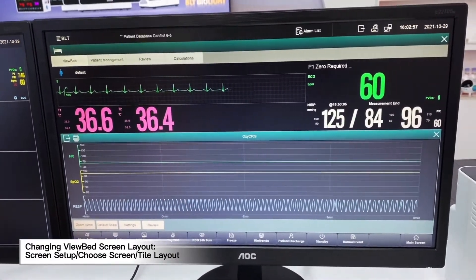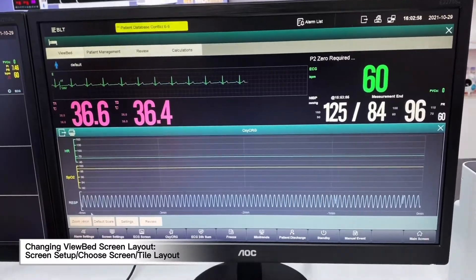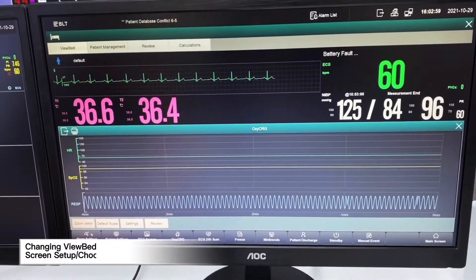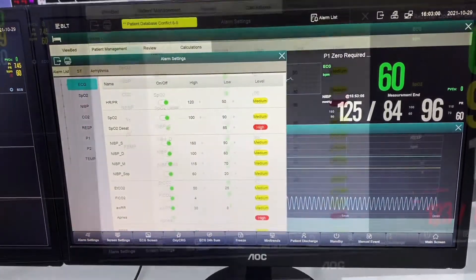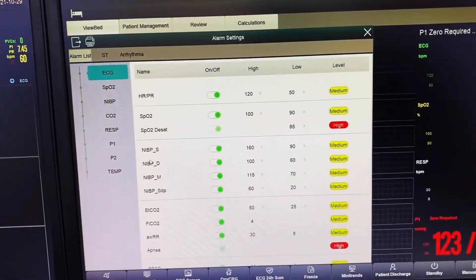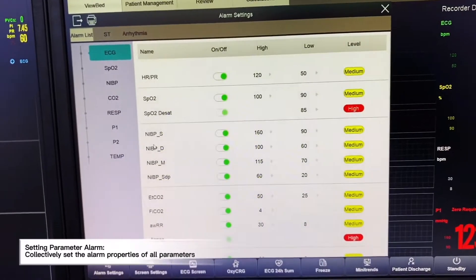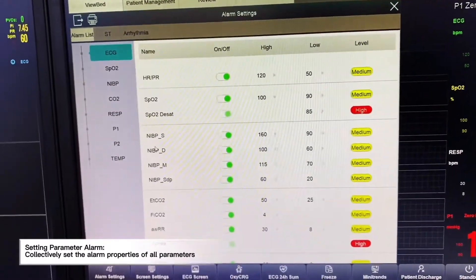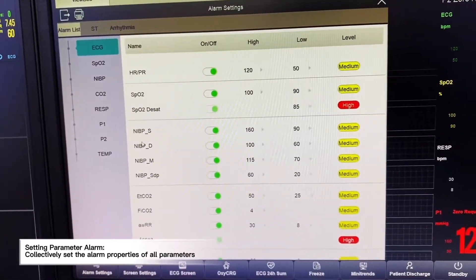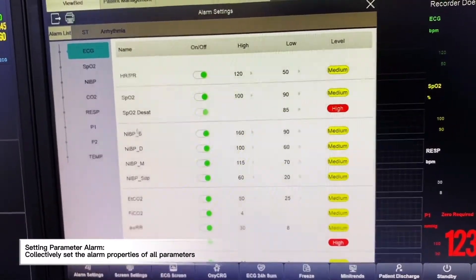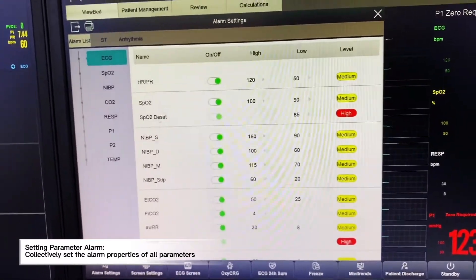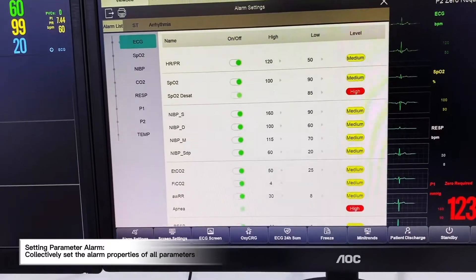The first option is alarm settings, where we can customize each and every parameter — alarm limits and alarm level — all on one page.